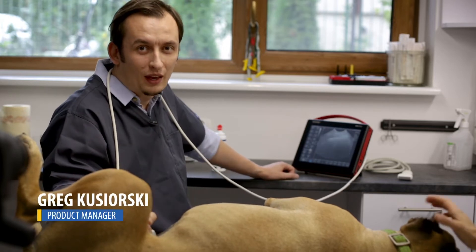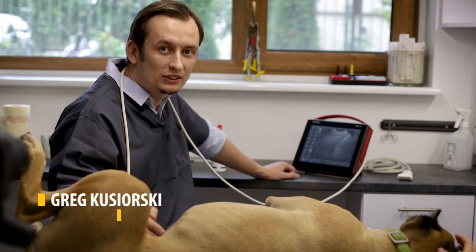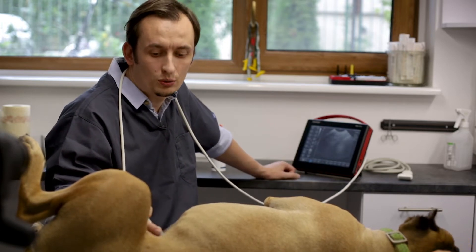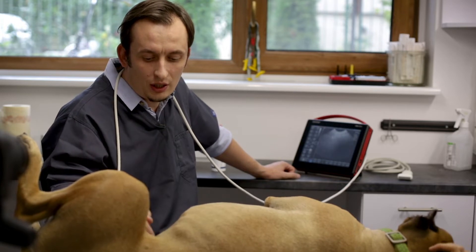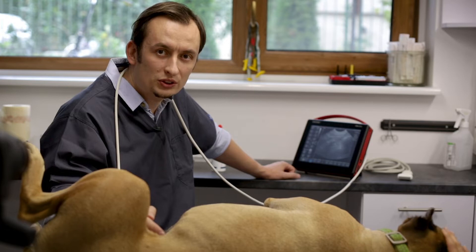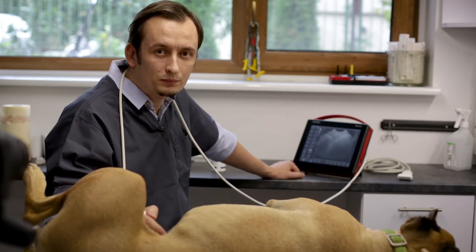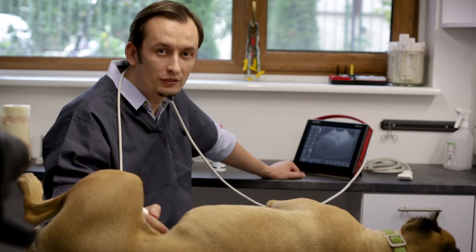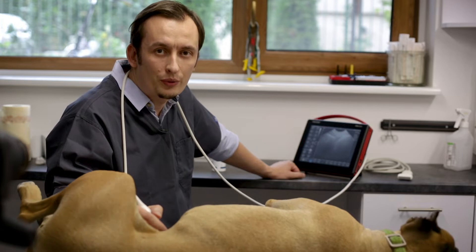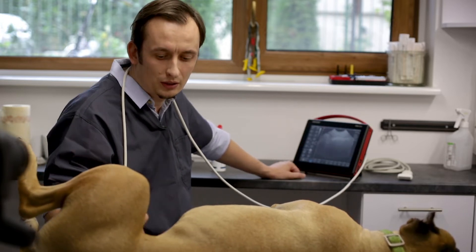Hi, my name is Greg. Last time I asked you to ask some questions about our devices and we got some, so today we decided to answer the basic questions like what probes to use in a small animal clinic and how to adjust the device. Later on we will answer the question about repro scanning in dogs.